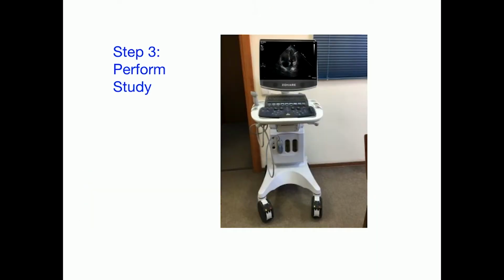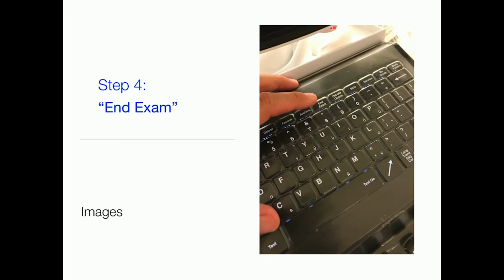Step number three, you'll perform the study, saving video clips and still images as appropriate. Step number four, end exam. When you click the end exam button, those images that you just acquired will be sent wirelessly to both QPath and to PACS for permanent image archival.